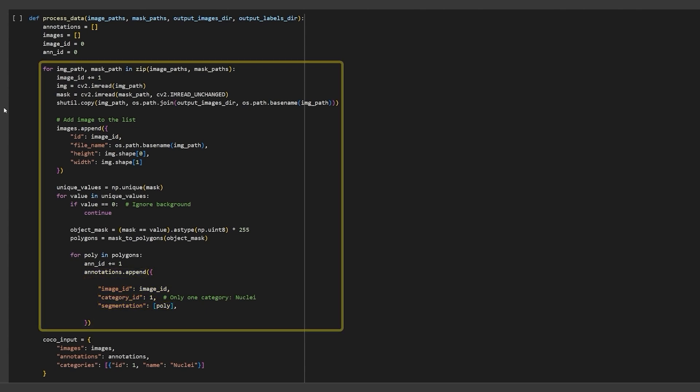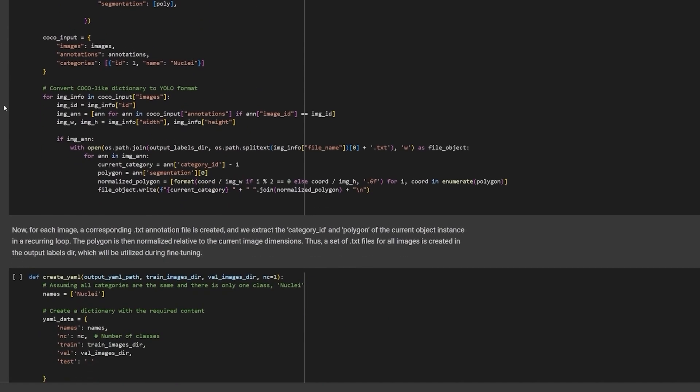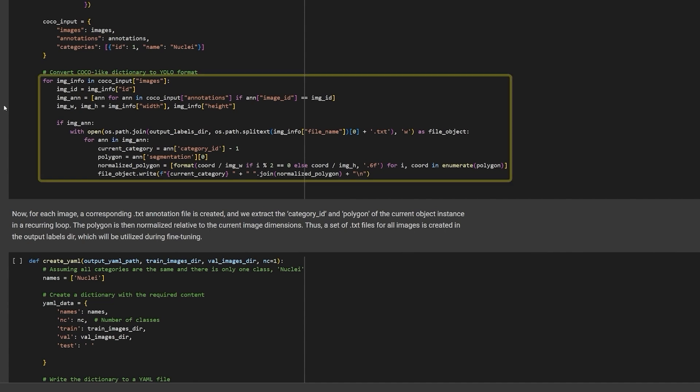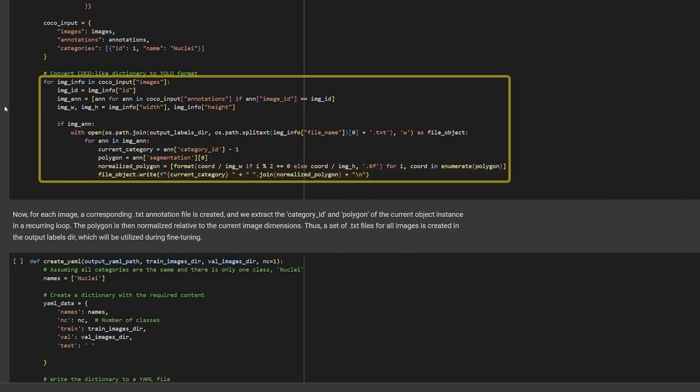Finally, create the Coco input dictionary by combining the images list and the annotations list, followed by the labels. Now that we have the annotations in the Coco format, we can easily convert it to YOLO format. Iterate through the Coco input dictionary and create a new text file for each image and dump the normalized annotations to it.